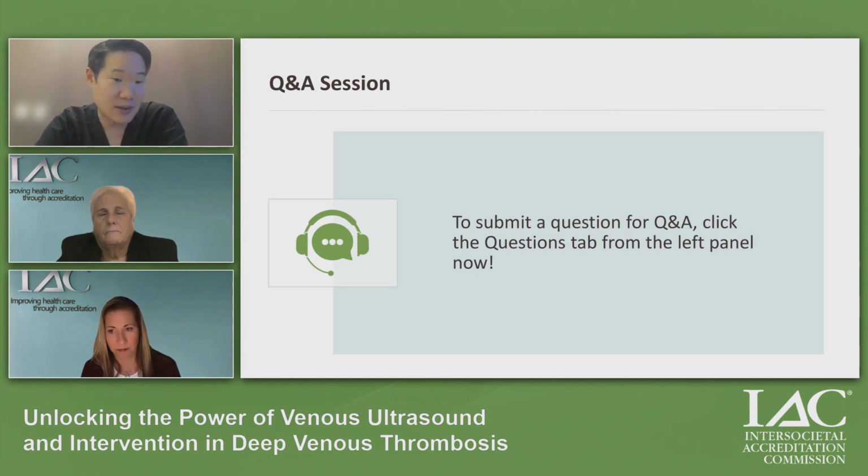And then particularly when, let's say, there is no DVT that you can see and you're trying to figure out what's happening, that may be a setting to use augmentation. And then in chronic DVT, I basically have almost no concern about an augmentation maneuver, other than that the patient will probably find it uncomfortable because of their chronic venous fibrosis issue, that even compression may be untenable for that patient. But they can serve a very significant value potentially for your patients.